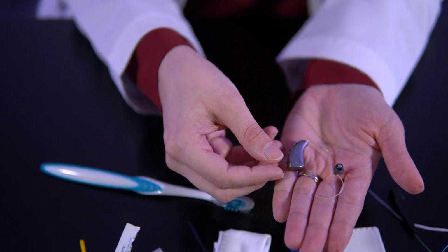And that's it. So just remember, we do like for you guys to try and clean your hearing aids about once a week. If you're not comfortable with it or anything like that, you're more than welcome to give us a call and set up an appointment, and we'll get you in for a clean and check. Or again, we like to see you about every 6 months, just so we can make sure that we do a really good deep clean, suction out your microphone ports and everything like that, okay? But you'll be successful at this. I know you can do it.